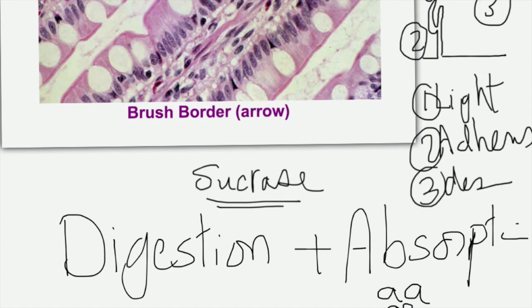As regards the LM picture, as you see here, you will find that it has an expanded upper part and a narrow cylindrical lower part. The upper part is full of the mucus which dissolves during preparation of the section, while the lower cylindrical part contains the nucleus. The nucleus here is dark and triangular, as you see very clearly in this picture. Triangular dark nucleus in the lower cylindrical part. This is as regards the LM.